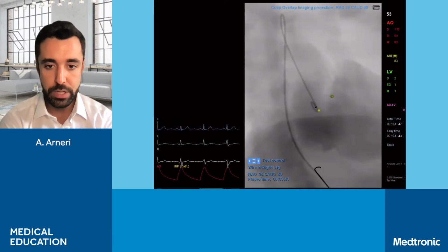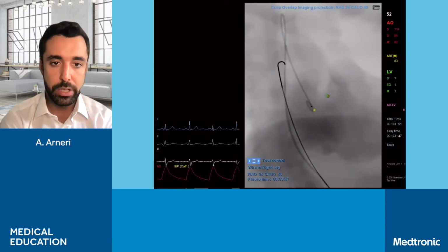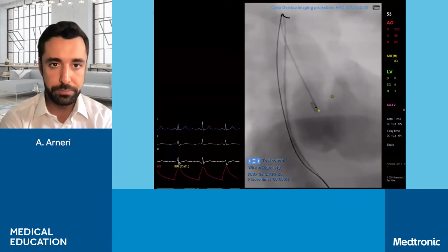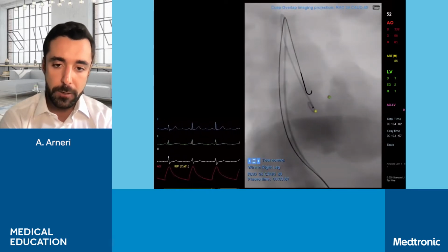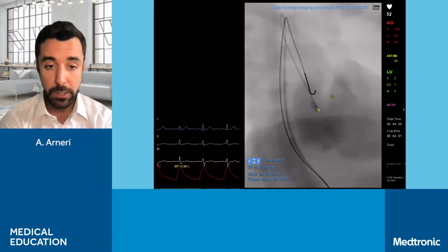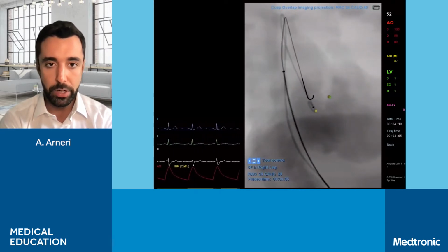into the patient. You see the J wire going over the descending aorta, then aortic arch, and finally the descending aorta. It's not traumatic for the vessels at all. And over this wire, we're going to move our AL1 catheter that, because of the shape of the tip, will be used to cross our aortic valve.